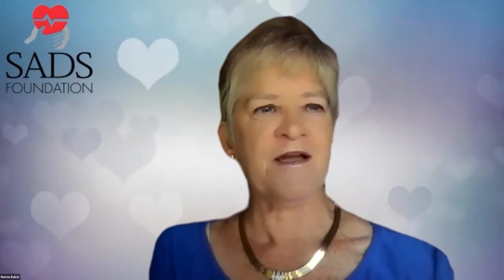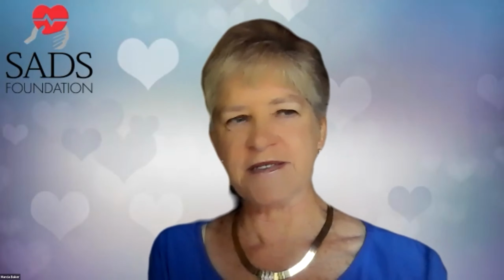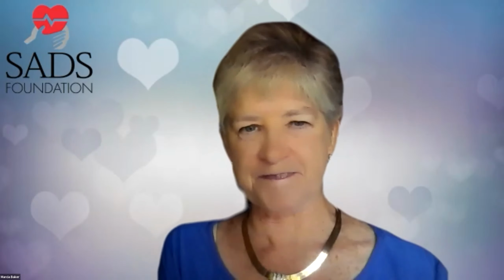Okay, thank you. How do you determine the settings of the ICD or S-ICDs? Another good question. So we determine the settings based on, again, the disease. I feel like a broken record, but the disease itself. Also things like activity level, lifestyle, all those things are important to us, what medications patients are on. And then we look at our programming at least on a yearly basis and think to ourselves, is this the right programming for this patient with this disease at this stage? And we make little changes all the time.